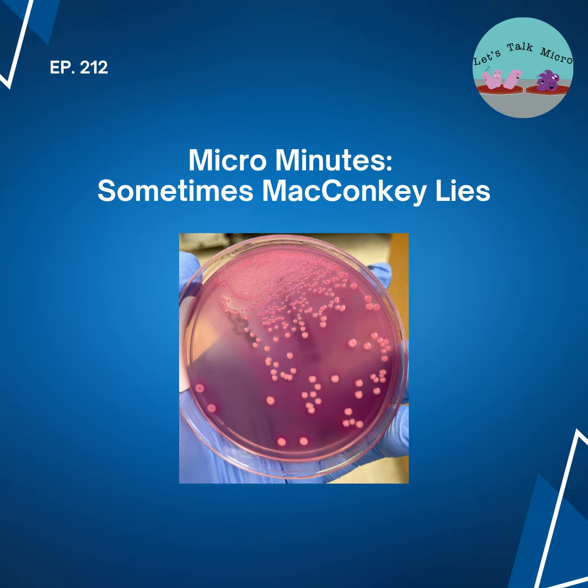And this is something that you see on media, and I have talked about this before. But even though some plates have a purpose, they have ingredients to select for some organisms and inhibit other organisms, you still get some presentations where other organisms that are not intended for the agar can actually grow on it. So the real lesson here is, MacConkey agar is a tool.